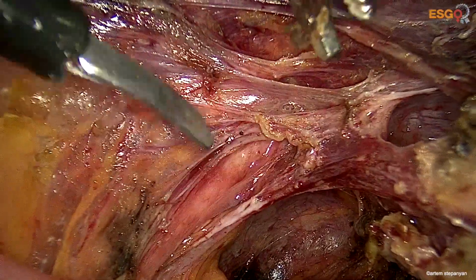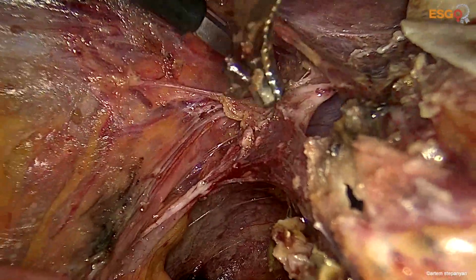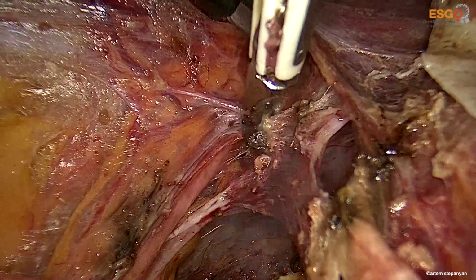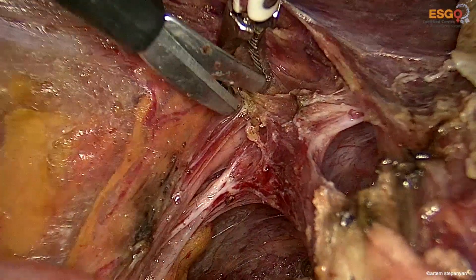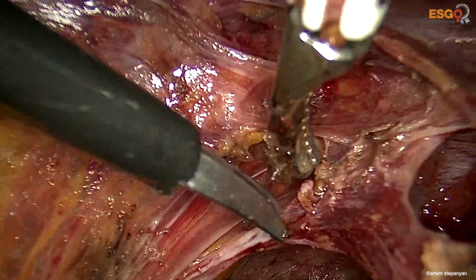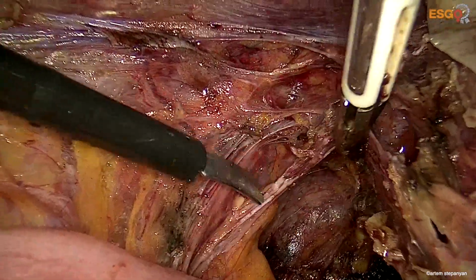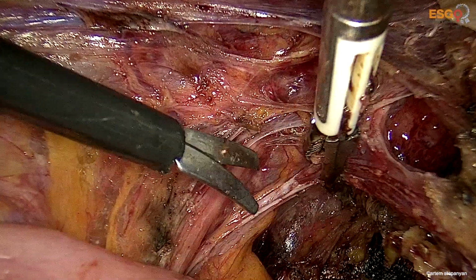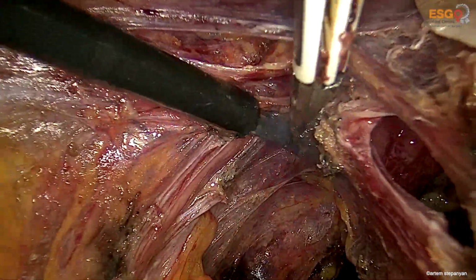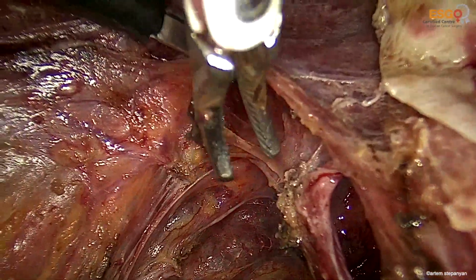Then we move to the left side again. Here we see the ureter, which is very well identified, and we keep it always under our visual control. So that we proceed towards the uterine vessels, at the same time detaching the peritoneum of the posterior leaf of the broad ligament of the uterus.